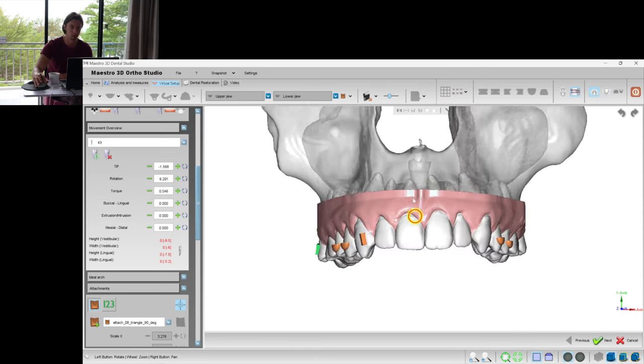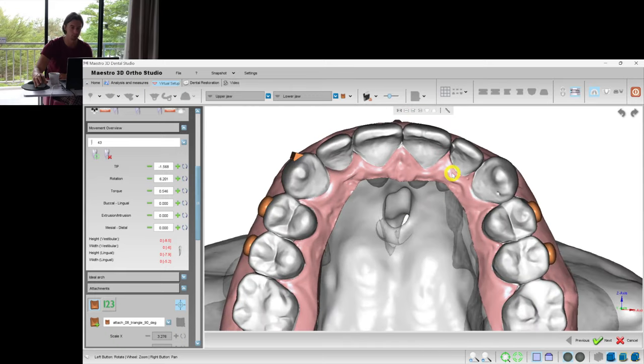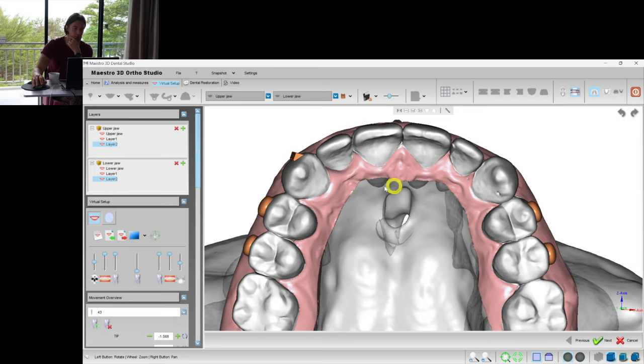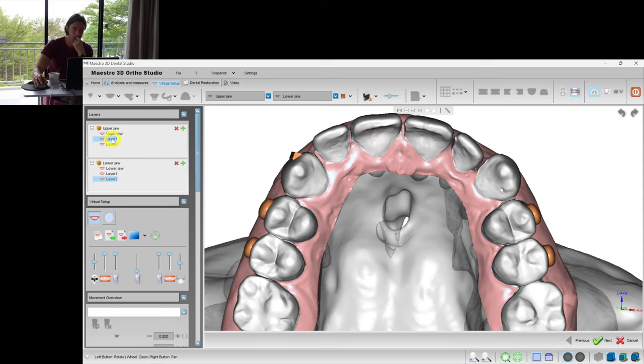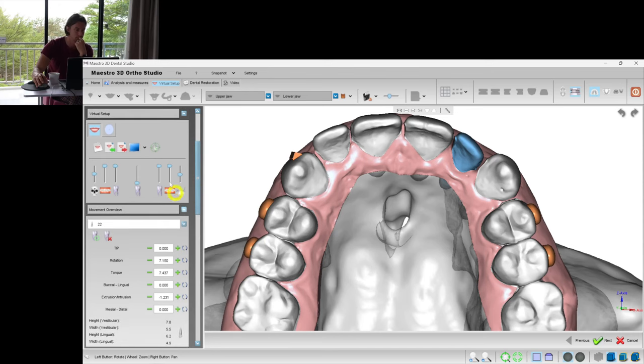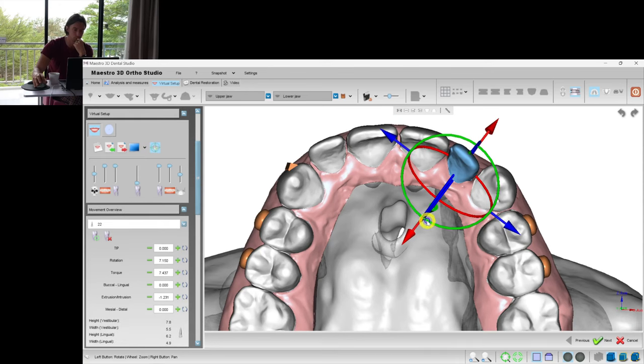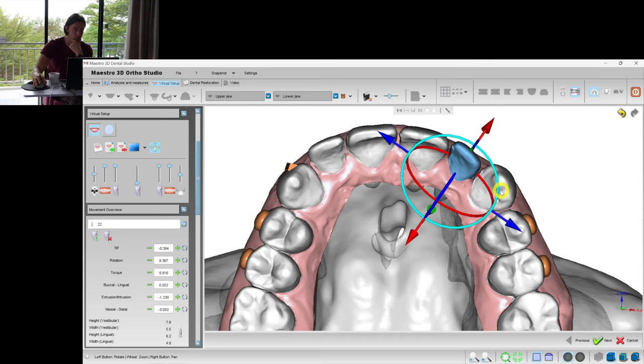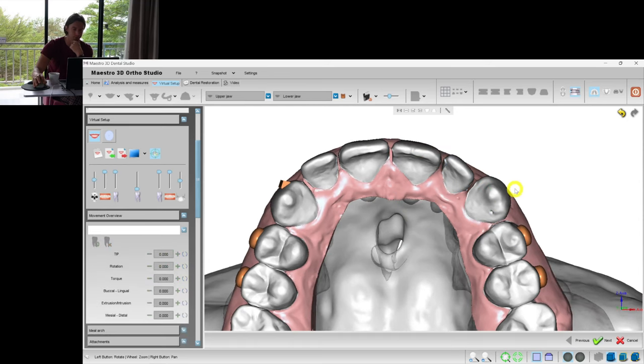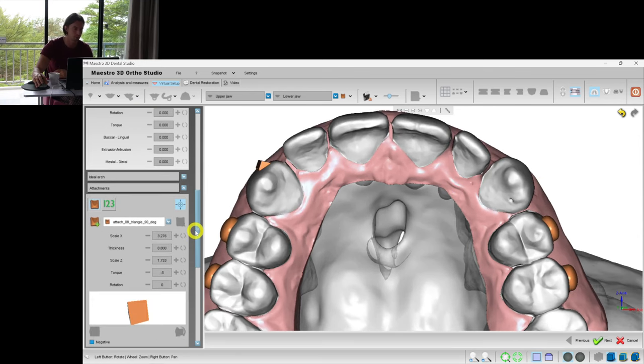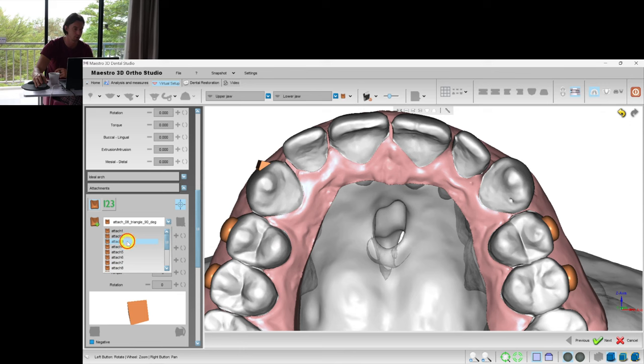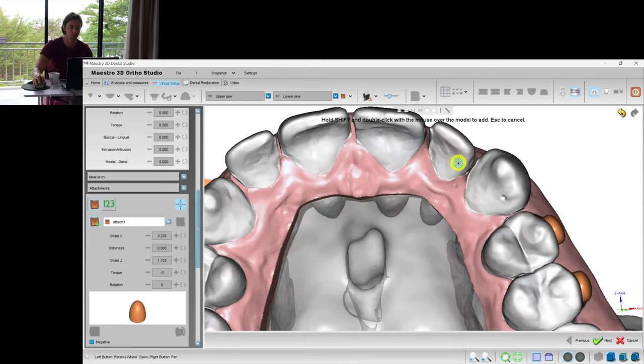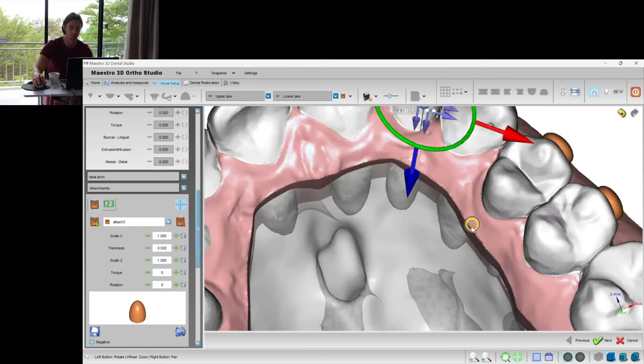And I think we should help this rotation for the lateral incisor on the left side. First of all, let's check, is it combined with the torque? Yes, it is. But let's rotate it and procline it more at layer 1. I prefer to put the most difficult movements at the very first aligners because we have the best fit between the aligner and the teeth.